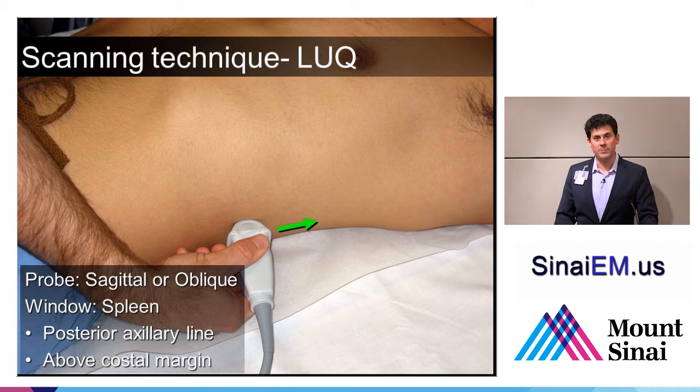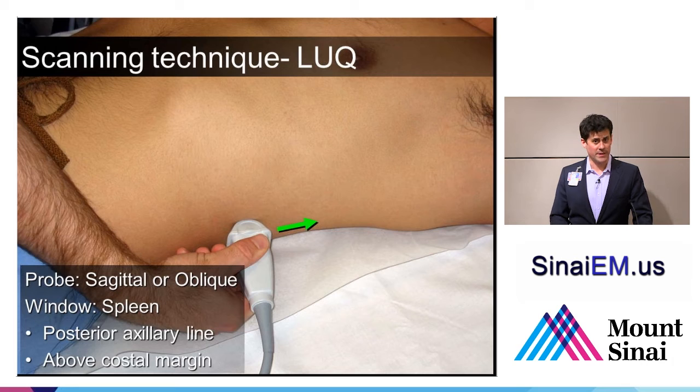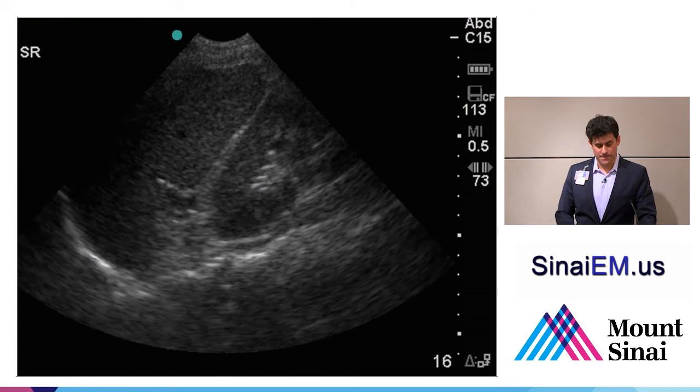You might even hold the probe a bit obliquely, where the probe marker is actually a bit towards the back of the bed, getting an angle of your ultrasound beam that's going to be more parallel to the rib spaces. So we're going to use the spleen as a window, and in this particular view, you notice the operator's knuckles are really scraping the edge of the bed. So it's very posterior. In comparison to the right side, the left side is going to be a higher hand position, closer to the patient's head, and a more posterior hand position towards the back of the patient.